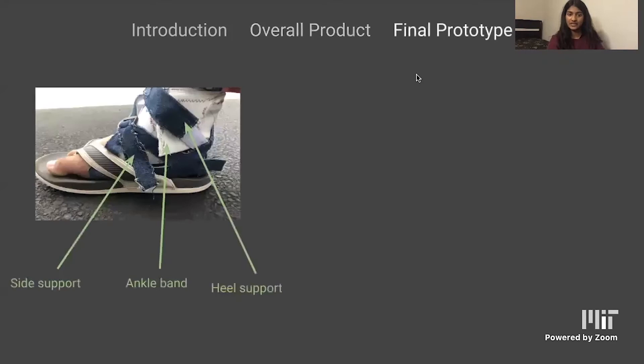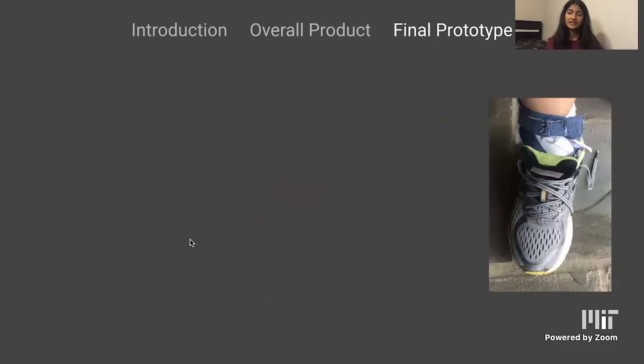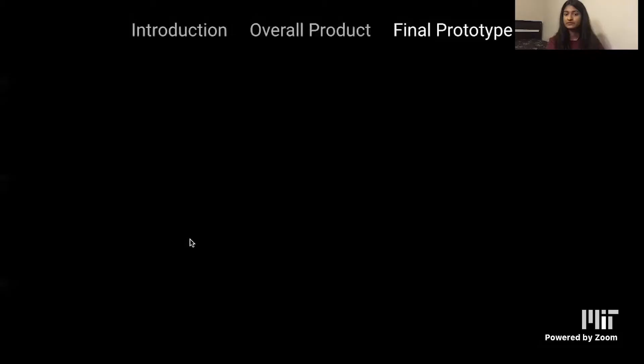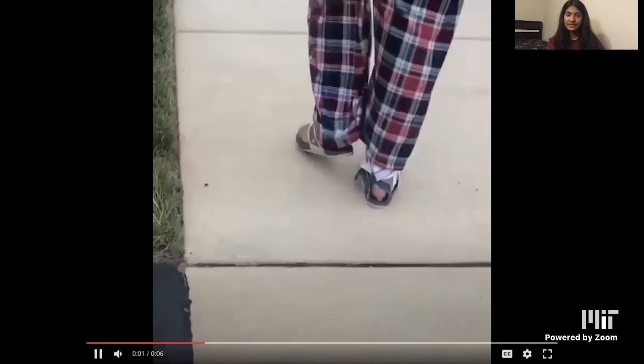For my final prototype, I included components to address those user needs: the side support aspect had foam along with denim to provide adequate support and comfort, along with an ankle band that wrapped around her ankle and arch to provide both arch and ankle support. The heel support kept everything in place while supporting the back of her foot. All of these components are adjustable. Here is her testing it with a sneaker. Here's a video of her walking — the product stays on her foot while she walks, so it's not on the ground when her foot is off. It stays in place and matches her foot movement.